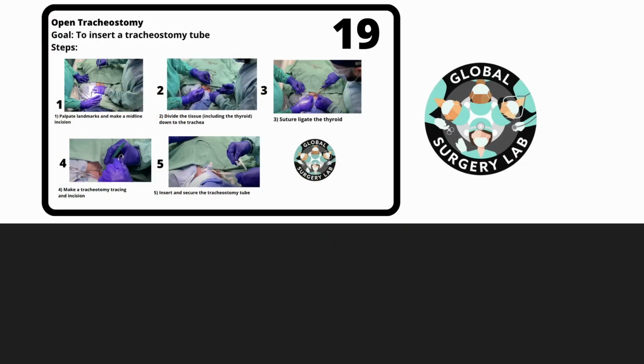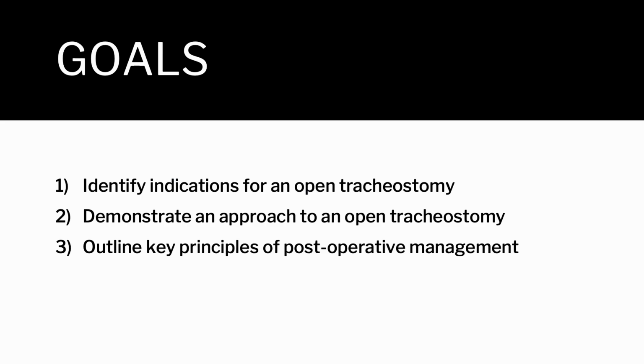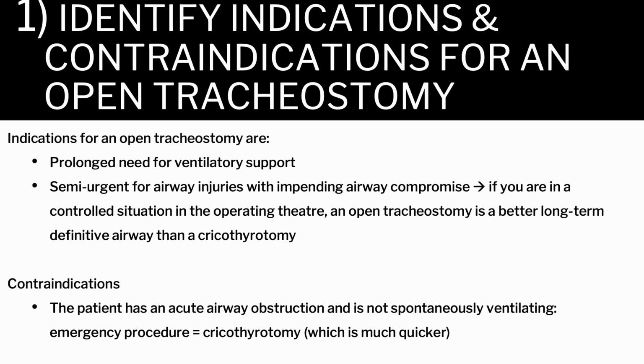The Global Surgery Lab presents an approach to an open tracheostomy. The goals of this video are to identify indications and an approach for an open tracheostomy, and to outline key principles of post-operative management.